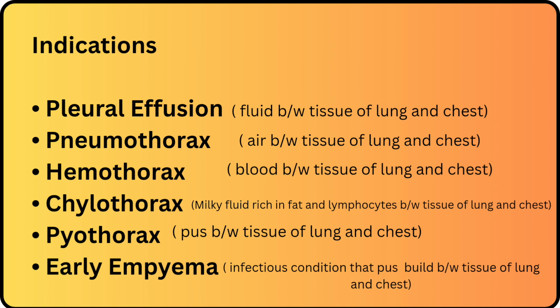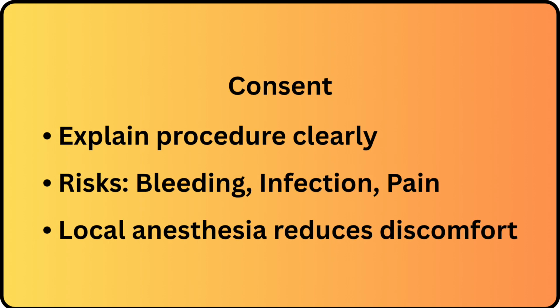Indications. Chest drains are indicated in conditions like pleural effusion, pneumothorax, hemothorax, chylothorax, pyothorax, and early empyema. Consent. Always explain the procedure, benefits, and possible risks to the patient, including bleeding, infection, and pain.